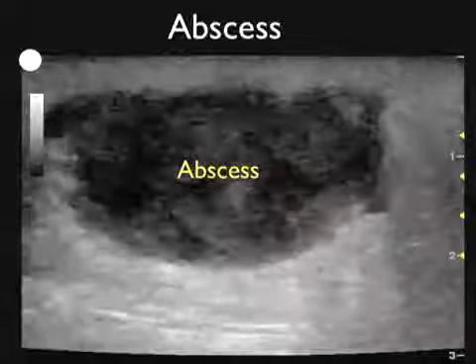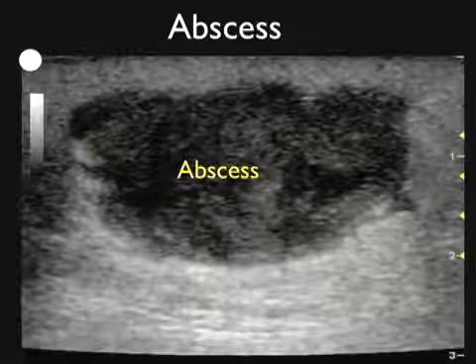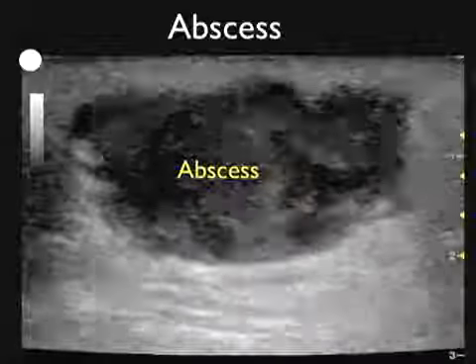So there's a little bit more fluid in this abscess cavity. But once again, no longer will antibiotics be enough. We'll have to perform an incision and drainage to complete a cure for our patient.